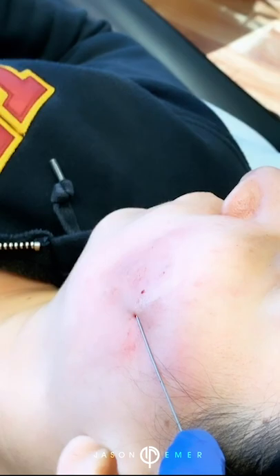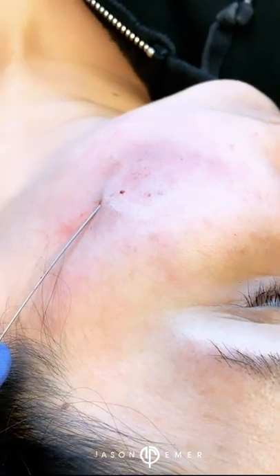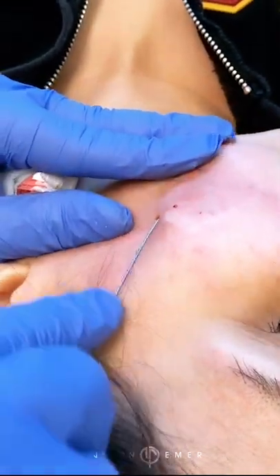You can kind of move over a little bit and show people a little closer. Look right there — you can see from one insertion point, I can literally reach your whole face with minimal pain. This is amazing.